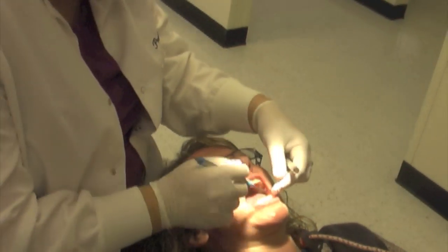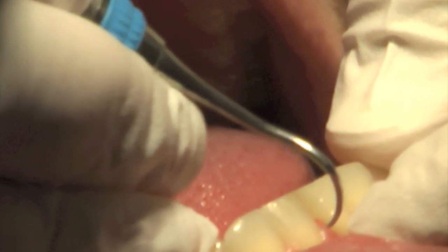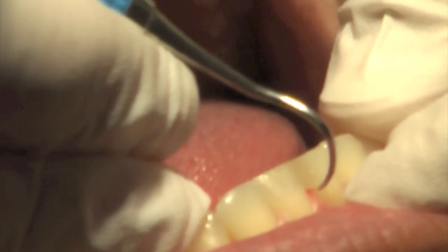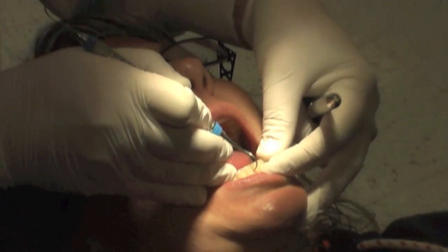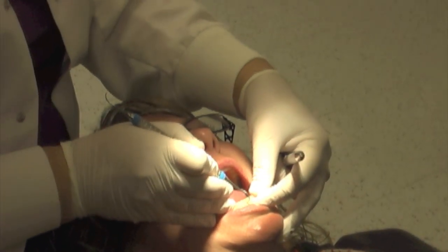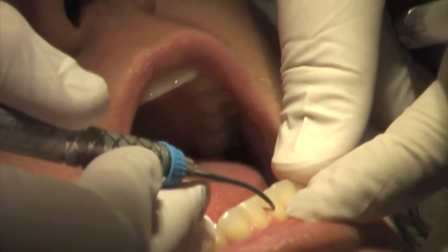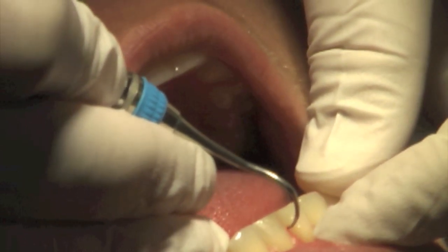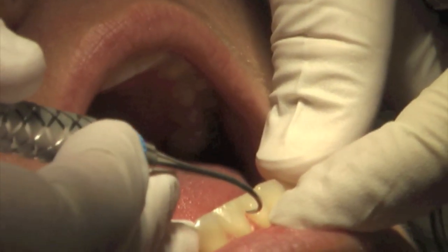If you're sitting at like 10 o'clock — which seems to be a favorite position for most students — and you're trying to go here, their innate instinct is to come away from the tooth with their stroke. For them to go laterally and then toward the toe kind of goes against where they're sitting, so they awkwardly maneuver their body. But they don't generally do that. They just do what's comfortable, which is to pull away from the tooth. That's going to cut the gingiva, hurt your patient, and you're not going to be very effective in getting deposit off.